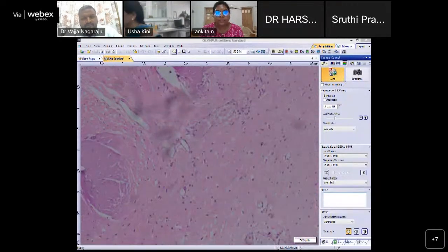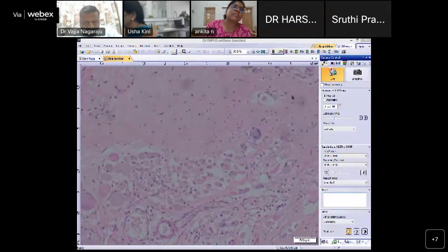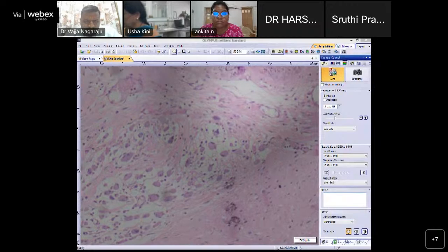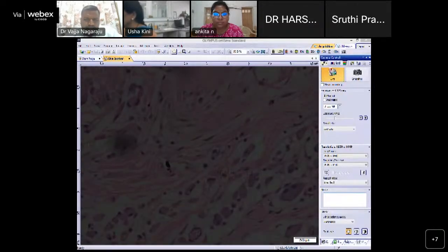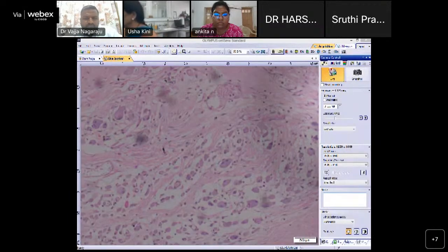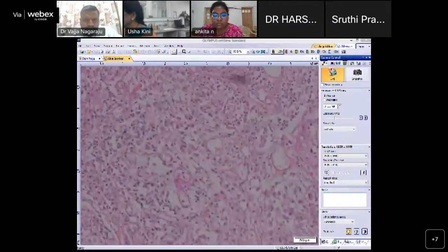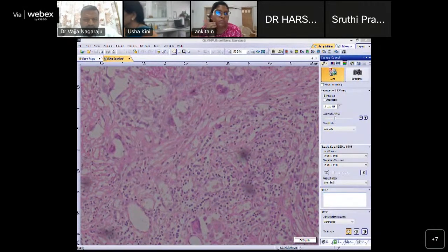Okay, so let us see, we'll handle these granulomas. I think we need to do that. I'm going to polarize.